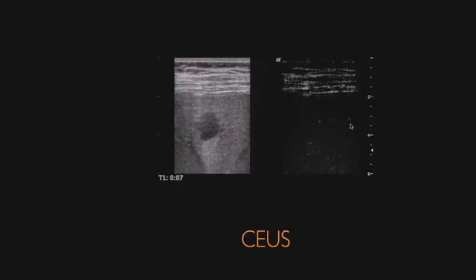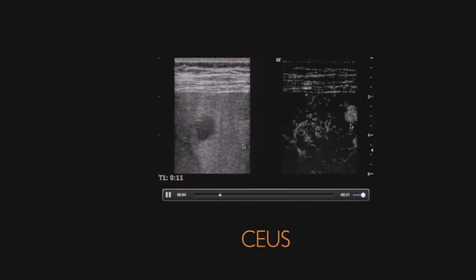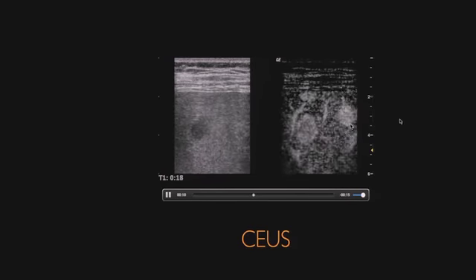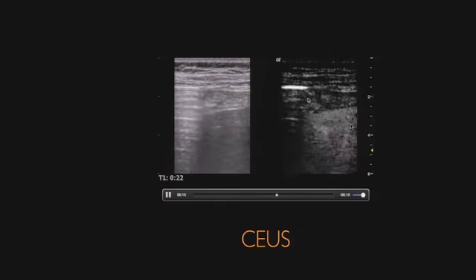This is the so-called cyst. It's not a cyst, it's a tumor. It is a metastasis from the melanoma, and it's not the only one. The next one is here, and next one is here. This one, subcapsular, measures 4 times 2 millimeters. And you can see the supplying artery of this tumor.